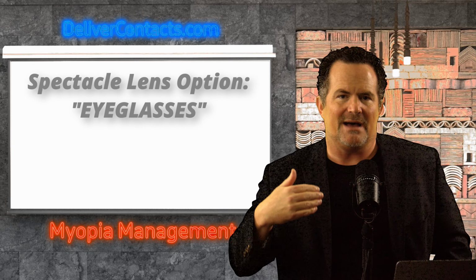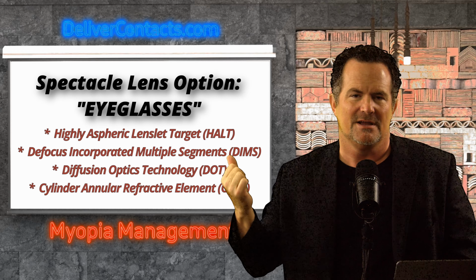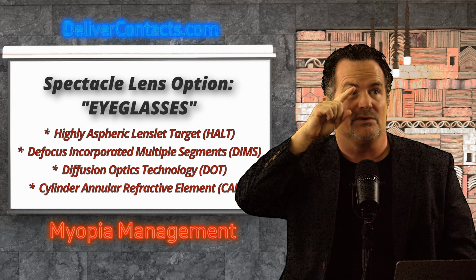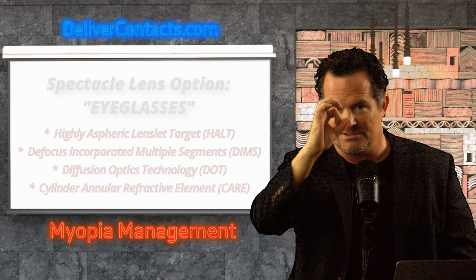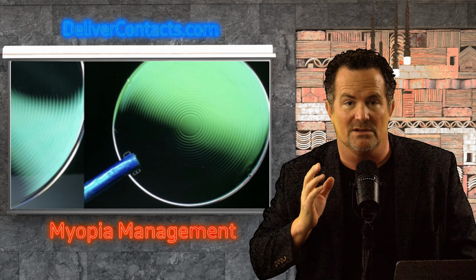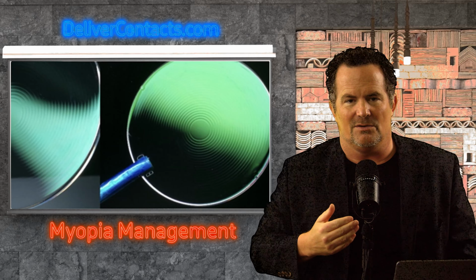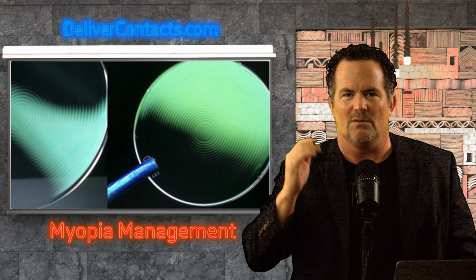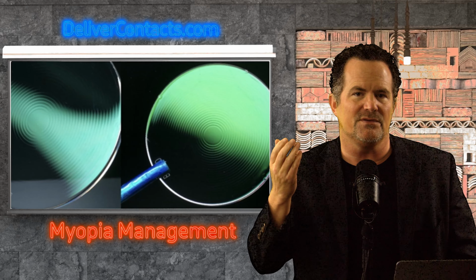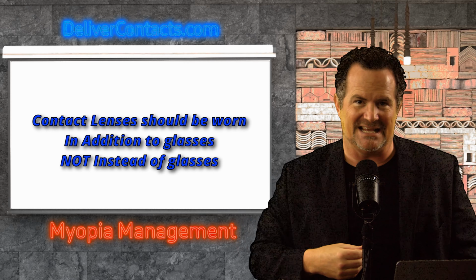On top of that, I think I made the point that there are also these peripheral defocus lenses, and there are different designs there. The problem with peripheral defocus spectacles, at least compared with the contact lens, is that when you look around, the contact goes with you. In glasses, there's a center area where all of your main central vision is, and if you look through the side of your glasses, now you're not looking through that optical zone, you're looking through that defocus zone. If you're somebody who's over 45 and wearing progressives, you know what I'm talking about. You get off to that side zone, it doesn't work as well. This is what I always say: if you're wearing contacts, you should always wear contacts as well as glasses, not instead of glasses.